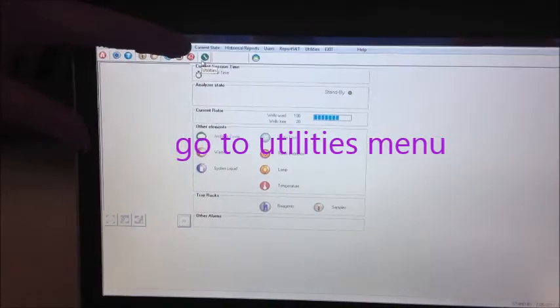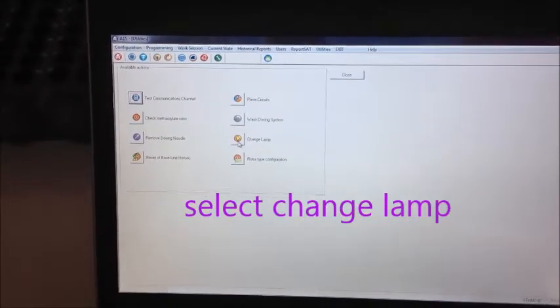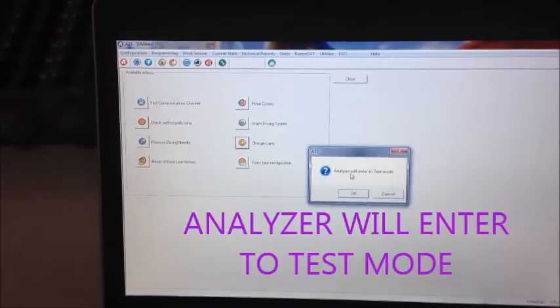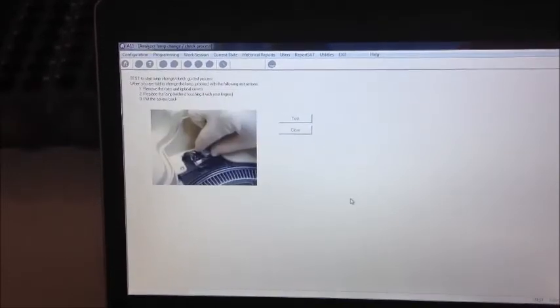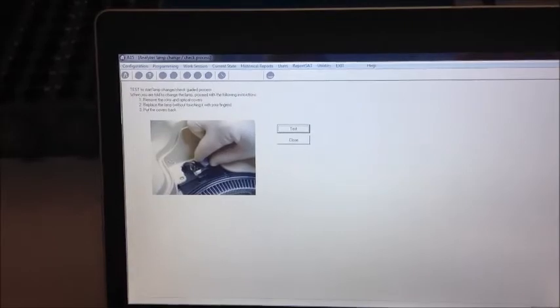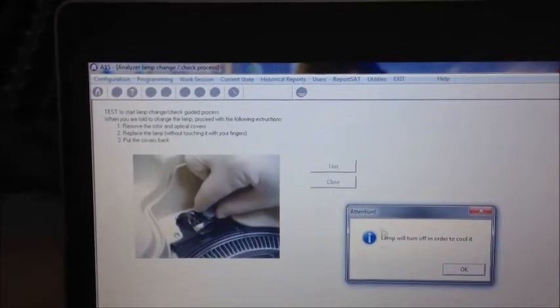Go to the Utilities menu in the User Software and select the Change Lamp option. A window will prompt — the analyzer will enter test mode. Click OK. In test mode, click Test and then click OK.